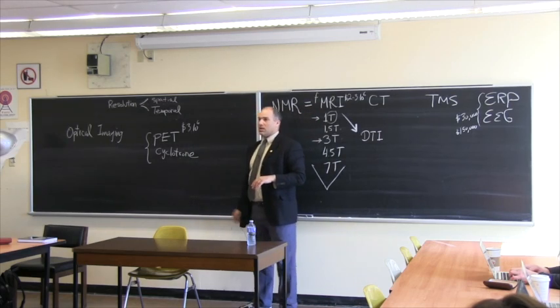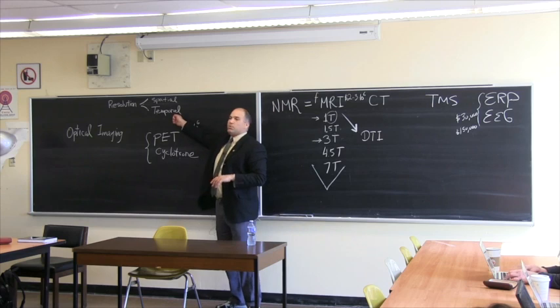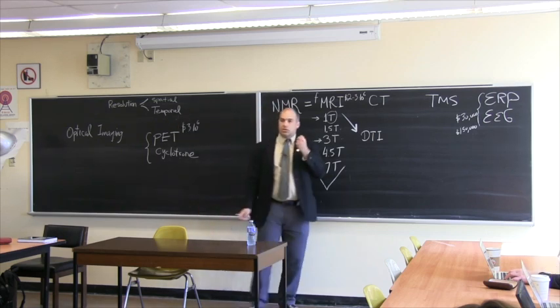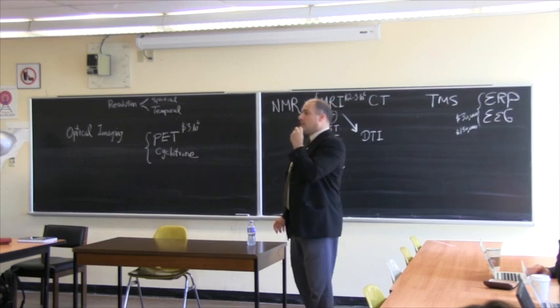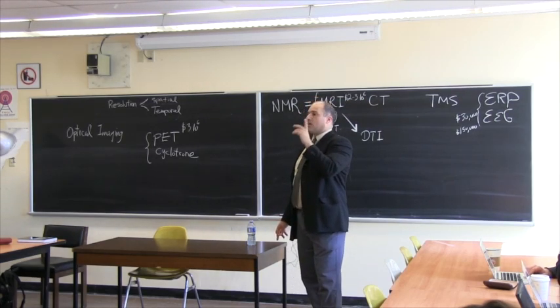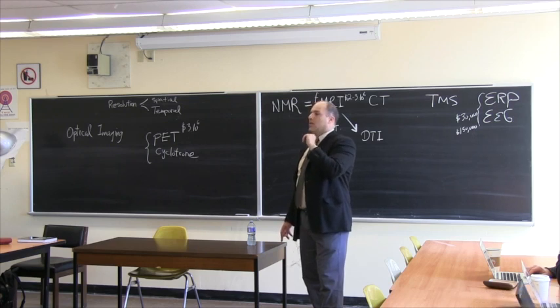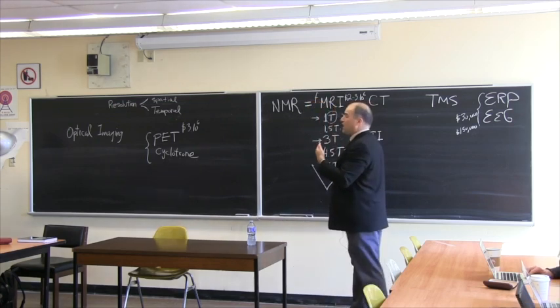It's slightly better than PET today, especially with dense arrays, when you have a lot of electrodes. Temporally, however, it's superior. Temporally, it's about 1 millisecond, at least in theory. It can go down to 1 millisecond because it's looking at very, very quick electrical signals. And those electrical signals basically spark at the speed of light, at least theoretically. And with all the shifting that we're doing, we're able to see things that are happening within a millisecond or within 2-3 milliseconds. So in terms of time, it's great.